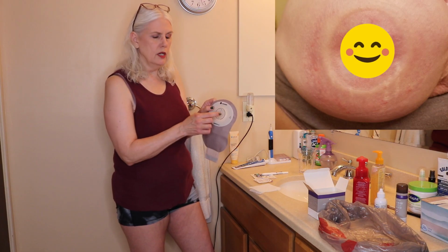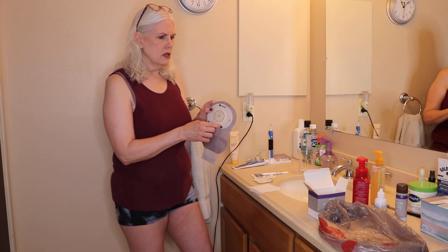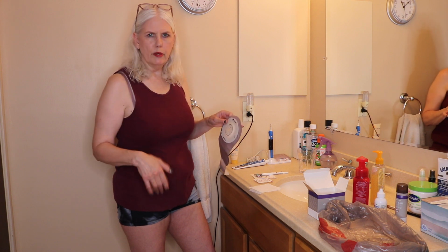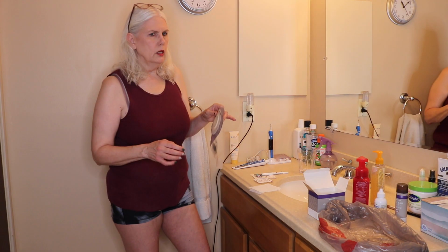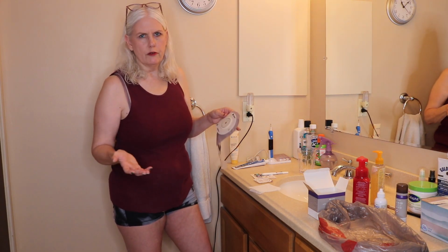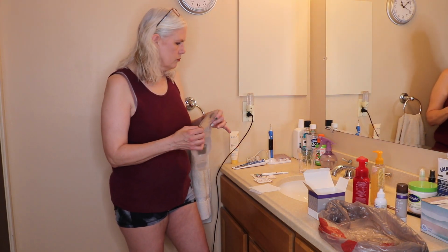So it wasn't along my stoma, it was more just on the skin area. So I did put some of the stoma powder on there, I did do the barrier wipe, and then I changed back to one of the other bags that I wear, and by the next bag change it was fine. It was all gone away.